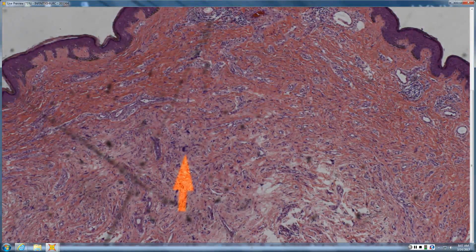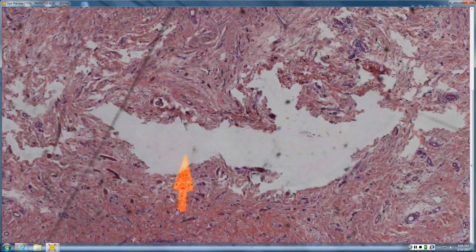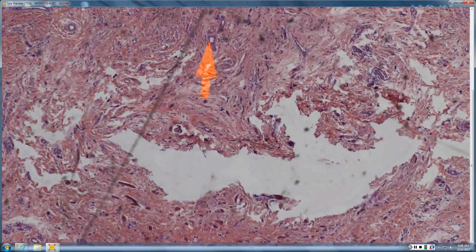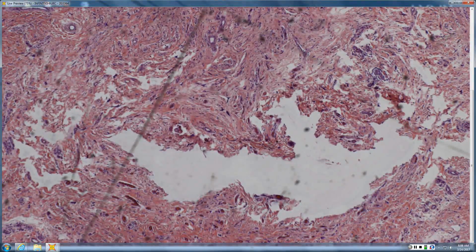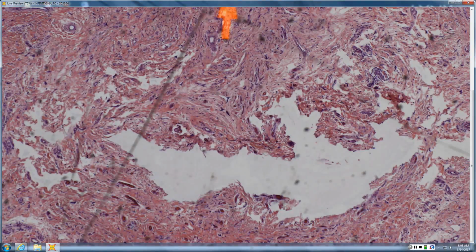The stellate cells look like the cells of a fibrous papule or angiofibroma, but it's a deep tumor that's kind of equally vessel and histiocytes, and the histiocytes are multinucleate and stellate. So: soft tissue tumor, equal parts angio and histio, and the histiocytes are often multinucleate, and the ones that aren't multinucleate tend to be stellate, like in a fibrous papule.